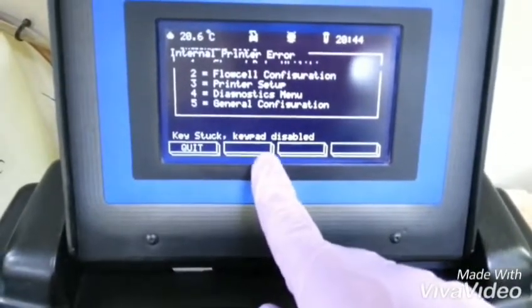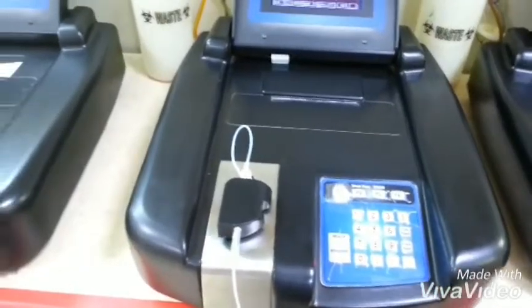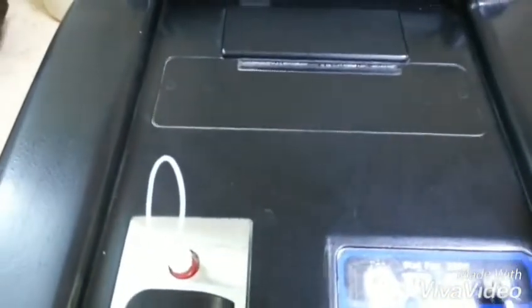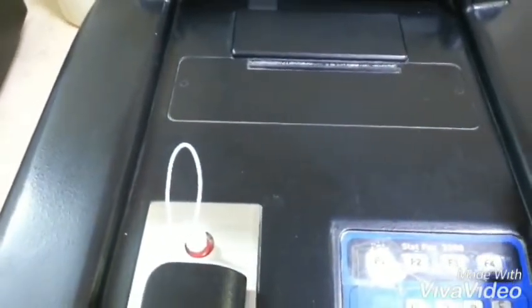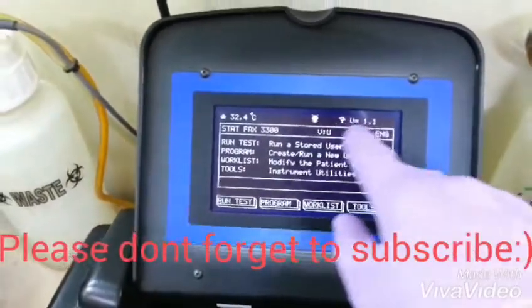Key stuck, keypad disabled. And this one also — as you hear, the motor is still running because of the flow cell. The valve is very low.